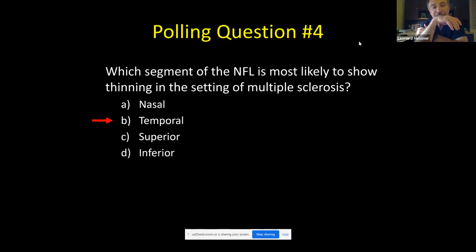But I think you bring up a good point within the question, and that is, do not expect neurology to do this. That's like sending a visual field back to a neurologist. That's not necessarily their game. Sending just the scan back, that's not necessarily their game. You own that. It's the eye. Sure, you can send the scan back if you want to get extra fancy, but the most important thing is to send a report back answering one of two questions: is it stable or is it getting worse? Stable or progressing, just that simple.